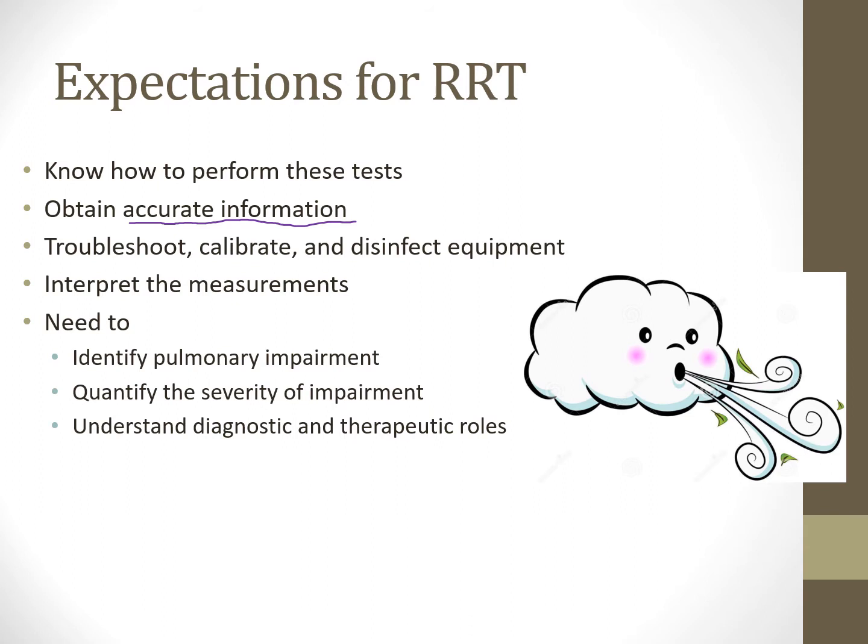Being able to troubleshoot, calibrate, and disinfect equipment is a big thing. And when we talk about disinfecting the equipment, especially nowadays with all the different types of respiratory things going on, it's very important that we take a big role in preventing the spread of anything respiratory, right? So troubleshooting the machine, calibrating the machine, these are all things that you might have to do, especially if you work in a diagnostic setting, or if you work in a setting that uses a lot of these machines daily. You're going to have to be able to troubleshoot and calibrate these.